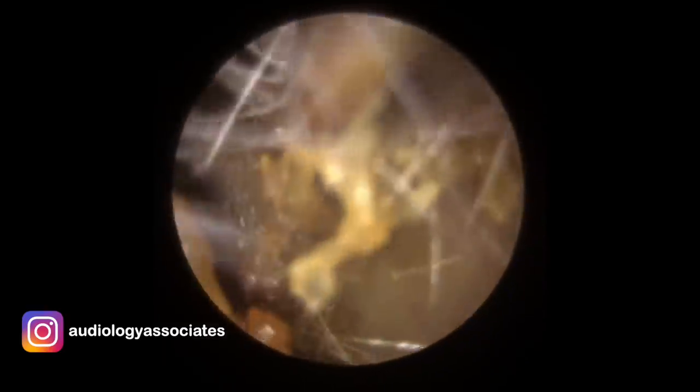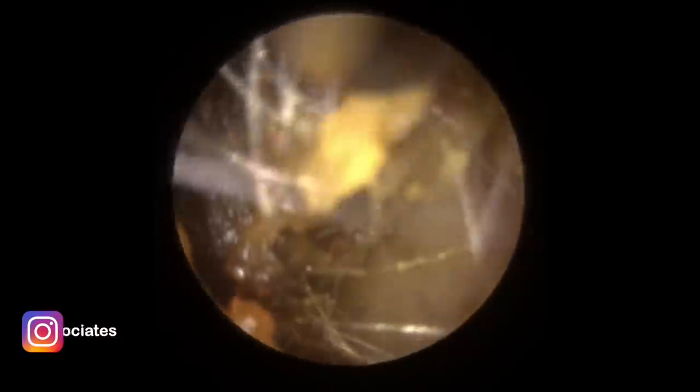The patient was finding it really difficult to tolerate the wider suction just because of the noise. So to make it a little bit easier and more comfortable for the patient, which is always your top priority in any wax removal, I've switched to the fine end. It tends to be, because you've got a smaller aperture at the end, you don't tend to find it as noisy in the canal.